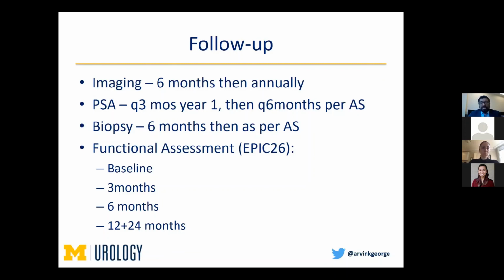Now, as for how they have described it, I have done two or three post-laser ablation. I've seen some more dense tissue where I was concerned that it was persistent cancer, but it actually took a bunch of margins and they've all been negative. It's just fibrosis. With true focal laser ablation, I didn't find it much different. However, those who have a lot of experience say that cryotherapy is the worst, followed by HIFU, because you can follow the area on the non-treated side and identify your plane in the treated side, followed by radiotherapy being the least amount of tissue effect.